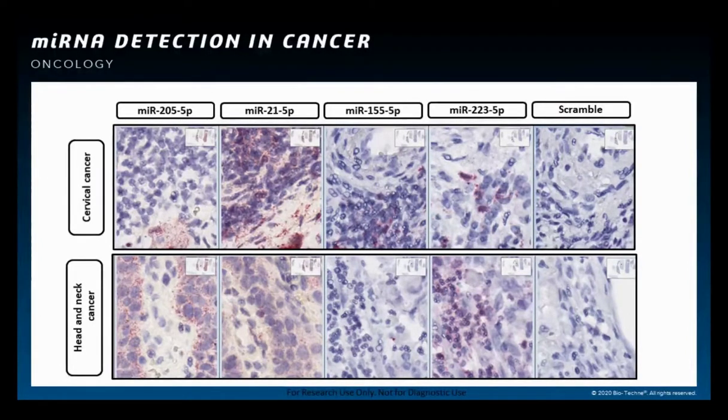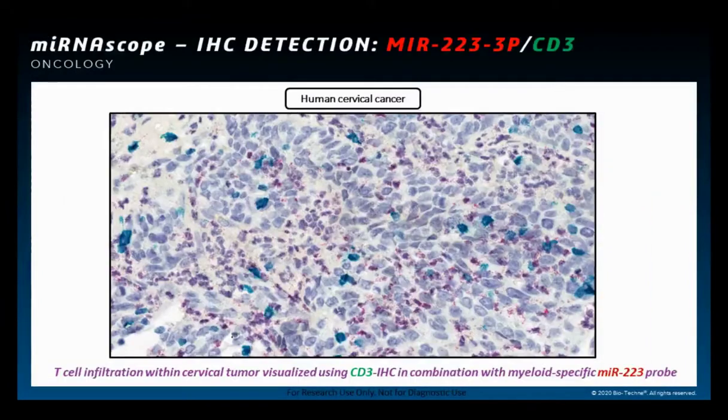And what we're seeing here is that those two microRNAs, together with the cells where they're expressed, are infiltrating these two particular cancers here. So in fact, these two microRNAs can be used as biomarkers to identify these two different cell types, ones that are from lymphoid origin and others that are from a myeloid origin. And lastly, we have the scramble stained tissues showing the specificity of this new assay. And of course, showing no signal whatsoever.